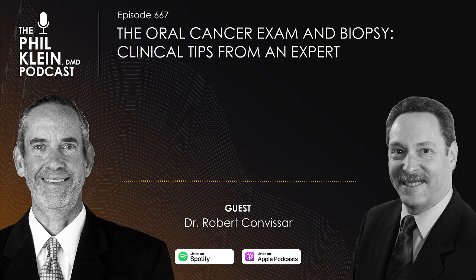So a little bit of common sense when you use FIGRUB, and you should have confidence in being able to figure out if you're looking at something benign or malignant. Of course, it's important to document the size of the lesion when you identify something, and you can do that through photographs. You take a picture with the perio probe horizontally and vertically, because that will tell you that it's 3 millimeters by 4 millimeters.